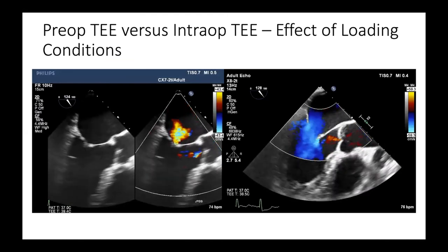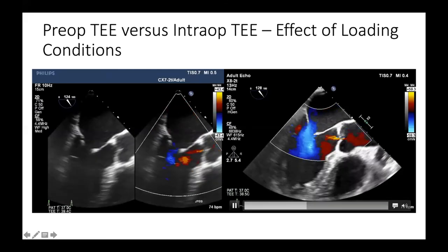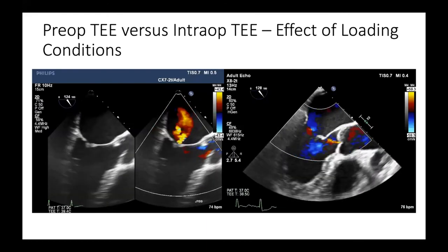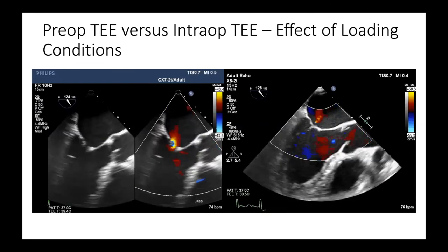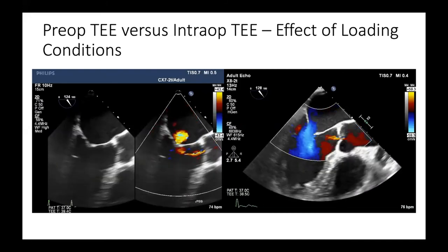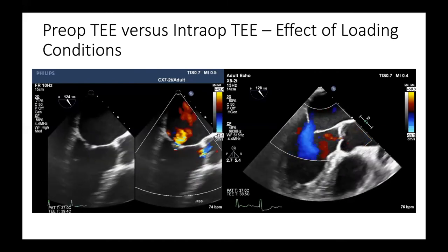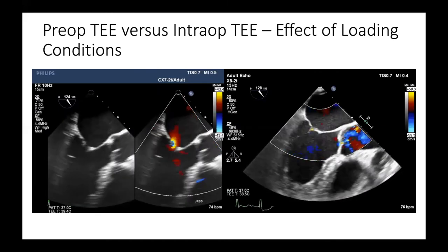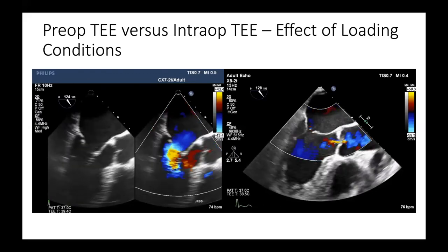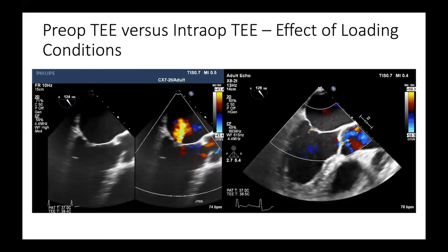Now you're seeing the pre-op TEE versus the intra-op TEE, which highlights the effect of loading conditions. The grading of MR severity can be significantly impacted by hemodynamic changes, particularly blood pressure. Hemodynamic variation can be seen with conscious sedation during TEE, but it's very challenging in the operating room due to anesthesia and vasoactive agents. You commonly encounter intra-op decrease in loading conditions or contractility, which leads to underestimation of your MR. If this patient had no pre-op echo, we may not have commented on the mitral regurgitation. This is why in functional MR we judge on pre-op TTE and look at the TEE for pathology, whereas for primary MR there's not that big a difference.